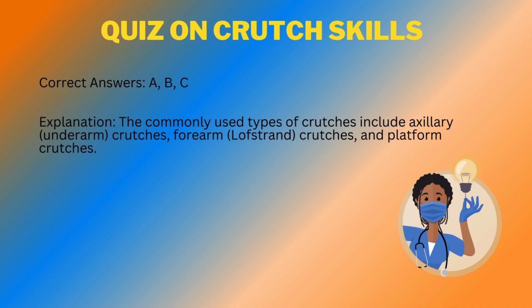Explanation: the commonly used types of crutches include axillary, underarm, crutches, forearm, Lofstrand, crutches, and platform crutches.